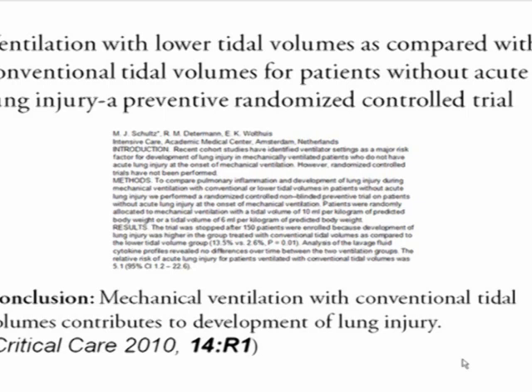This is a randomized controlled trial. They put patients on what we would consider normal tidal volumes for non-lung injury patients, which is 10 cc's per kg, versus low tidal volume strategy, which is what I'm going to tell you about. And those patients' lungs did not do well on the conventional ventilation. Even though they had no lung injury, they had nothing wrong with their lungs, they were just fine. So any patient, when not managed with lung protective ventilation, which is what I'm going to teach you about, does worse.